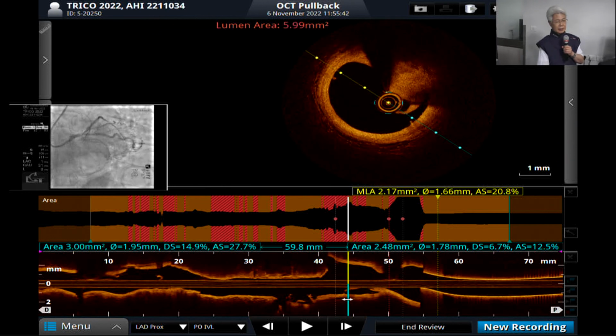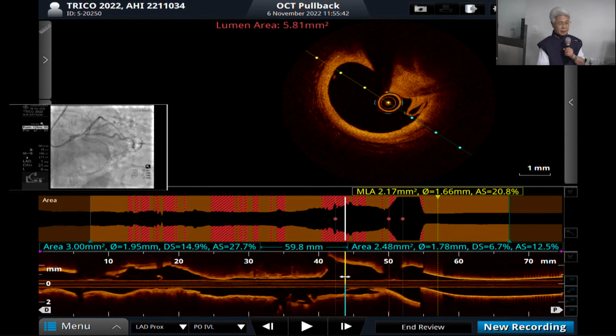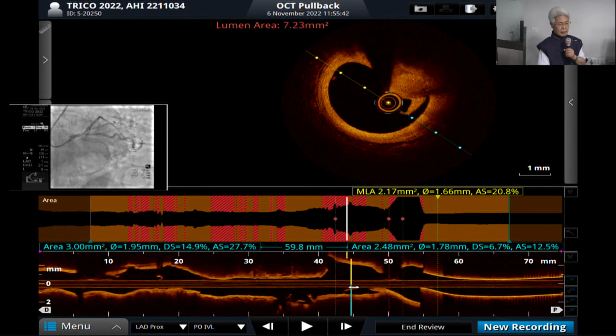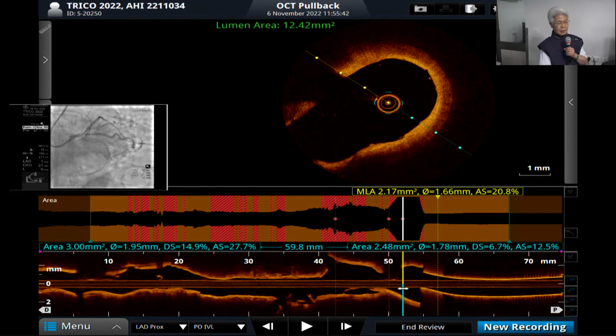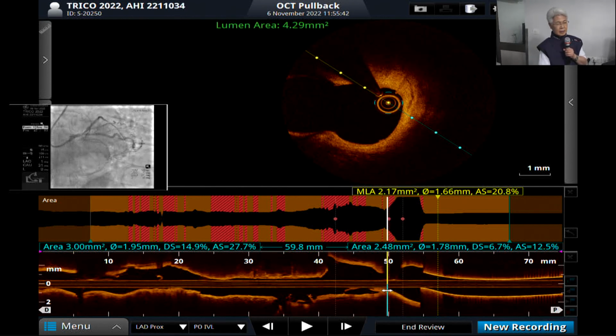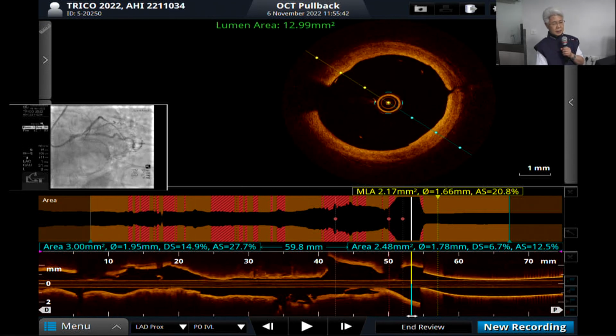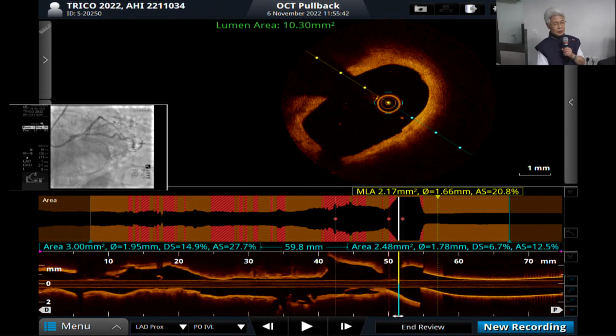Some crack. Yeah, there's a blood clot. Yeah, we can identify the crack. But somehow the landing zones, the proximal landing zone looks very clean. I don't know why. See? Distal landing zone. Proximal and distal both. Yes. Proximal landing zone.